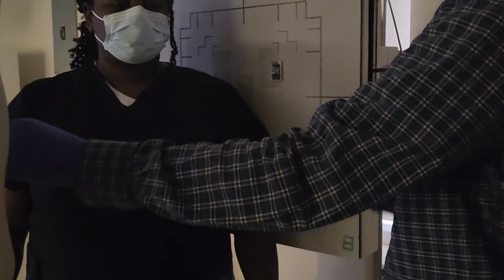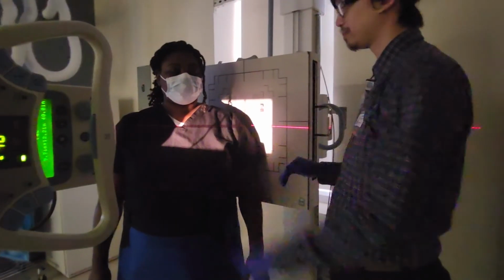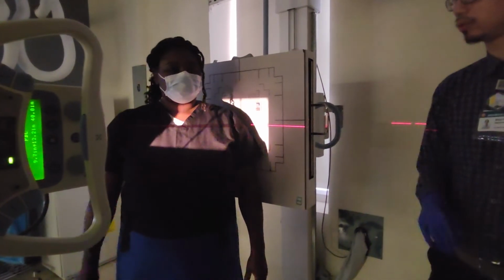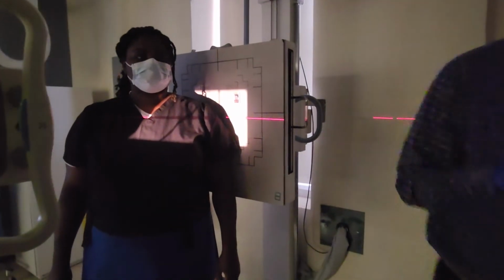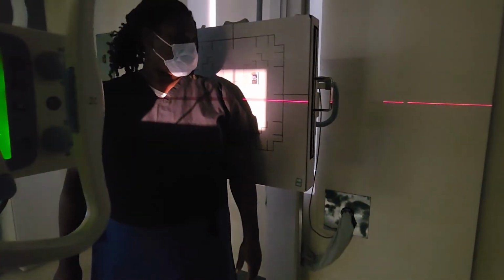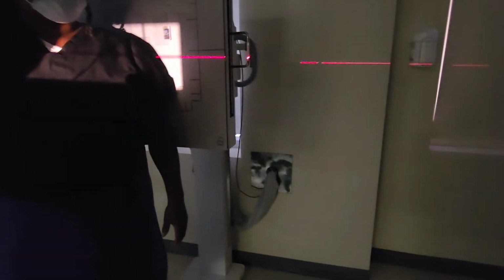Does that make sense? Are we clear as to why we need to oblique? Yes. That's right, to visualize that joint space. Okay. Let me just double check something real quick.